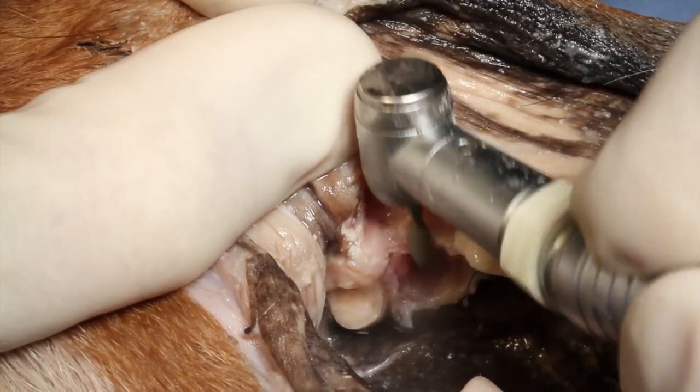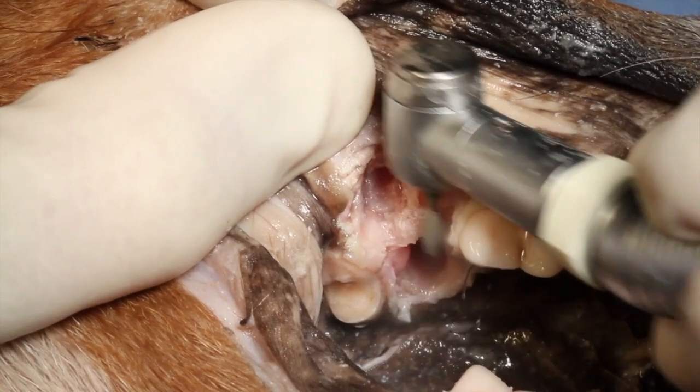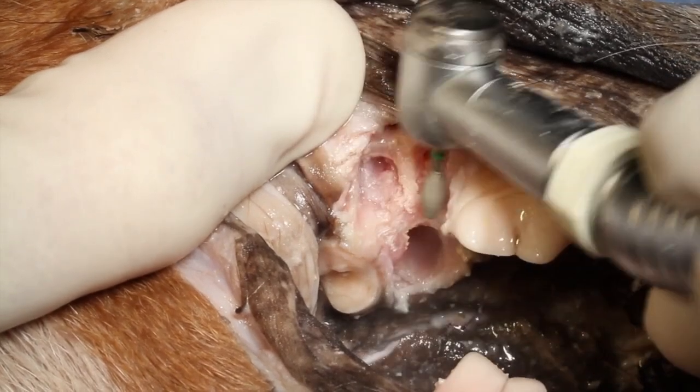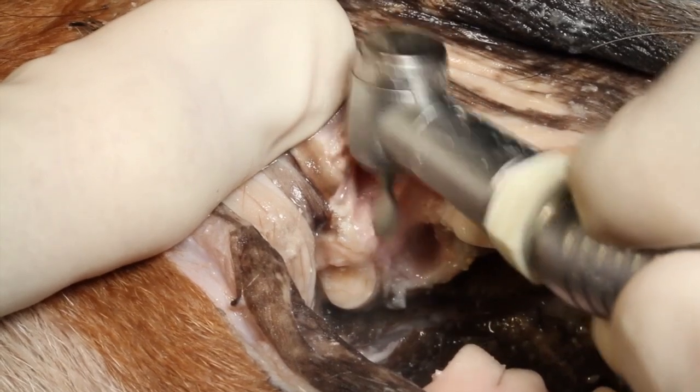Once we're through extracting all three roots, we'll take our diamond football burr, smooth the bone, make sure there are no sharp edges, and eliminate any debris.